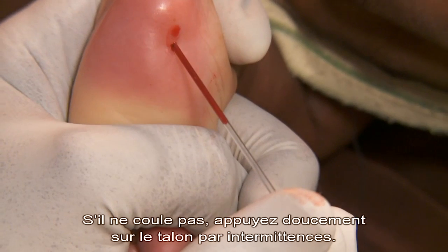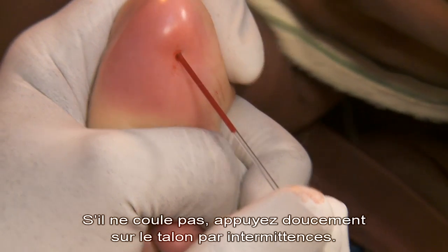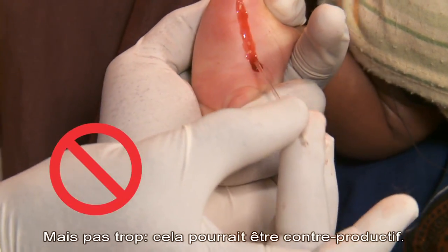Hold the tube to the blood to fill. If blood is slow to come, squeeze the heel gently and intermittently. But not too much — that can prevent accurate results.